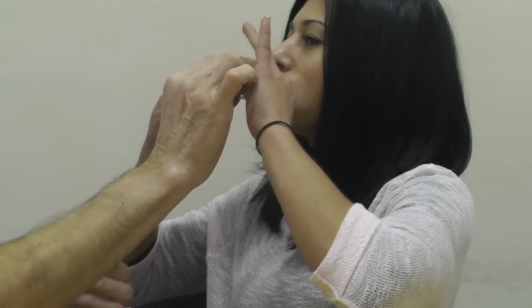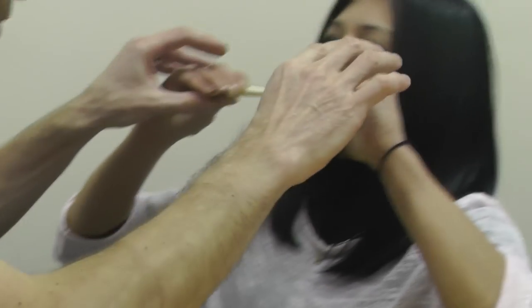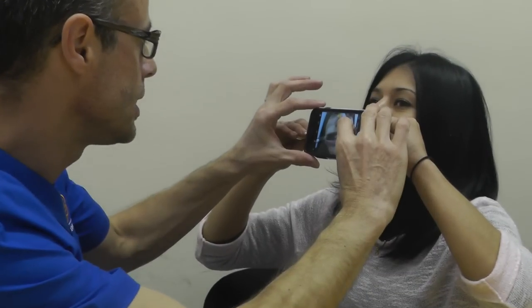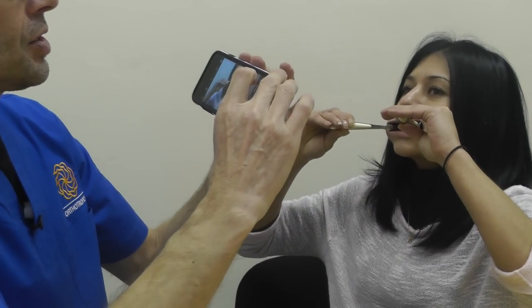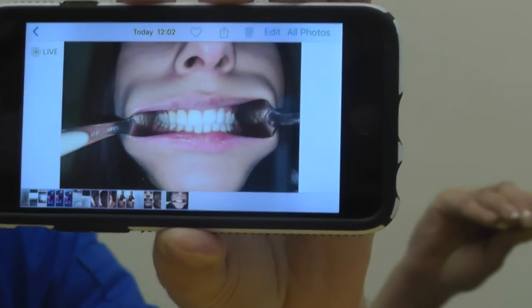Can you hold that one there? Roll your fingers up, then pull those to the sides, and then smile — don't pull too hard, smile. What I'm missing in the vertical I'm gaining in the lateral. That's what I want right now — I want to gain that lateral. I hold my phone, I've put the flash on, and I come in nice and close. Get that on the right eye, and photograph. So we've taken this photograph.